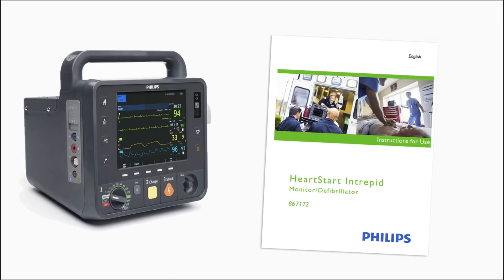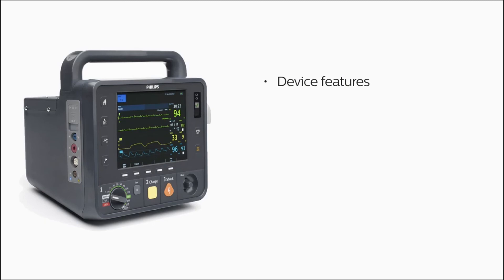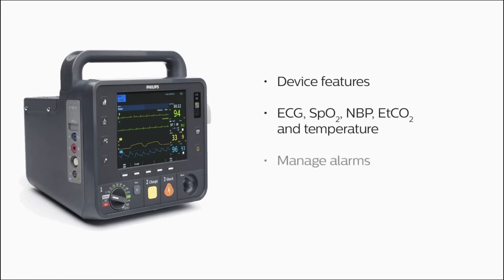In this program, we'll provide an overview of the HeartStart Intrepid's features, explain how to monitor ECG, SpO2, NBP, ETCO2 and temperature, manage alarms, and display trending data.